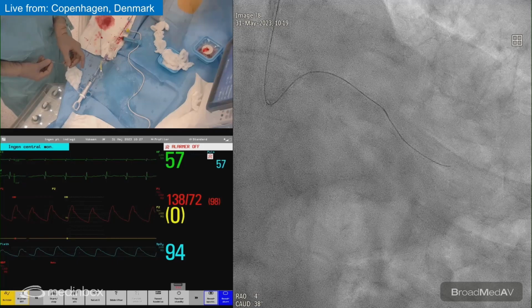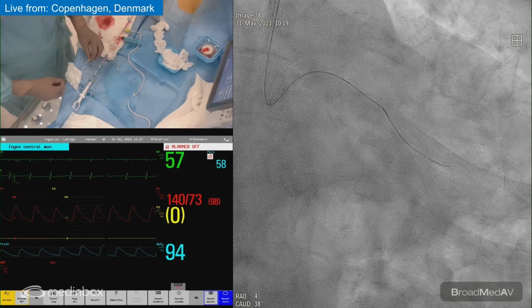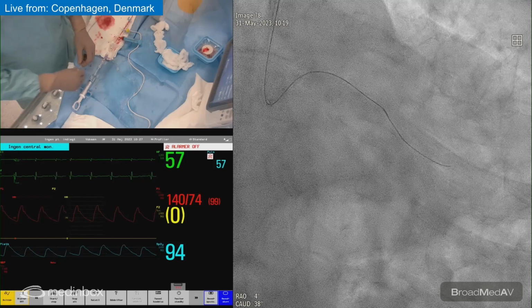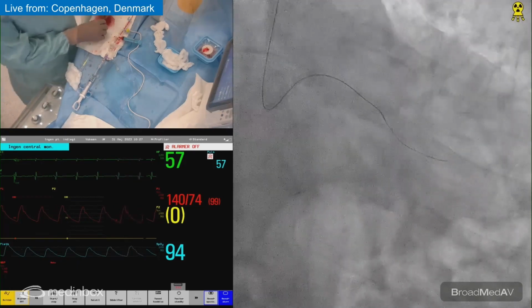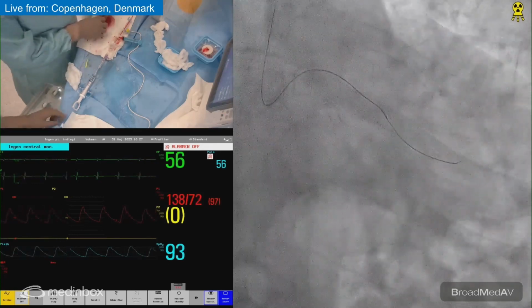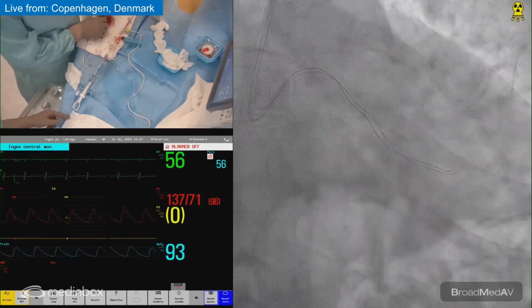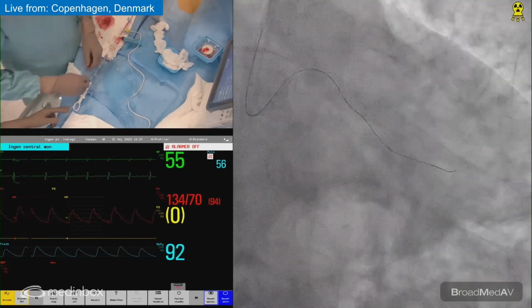So we have to get the catheter down so that the wire will enter almost directly into the side branch and not into the CTO, which will make it more difficult to get into the true lumen. As you see Francis doing now.